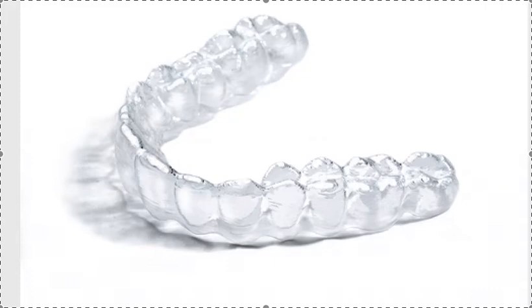Of course, one thing they really didn't do was improve the product. Yeah, they changed the aligner material. They went and bought Bay Materials, which is a thermoplastic company based in Fremont? Yeah, Fremont. Milpitas? Anyways, it's where I'm from. So one of those cities in the East Bay. I've been there. I've done some cool videos there before Straumann bought it. And so they did switch the thermoplastic material to a better material than they were using before, which was Zendura A. I think it's Zendura FLX.